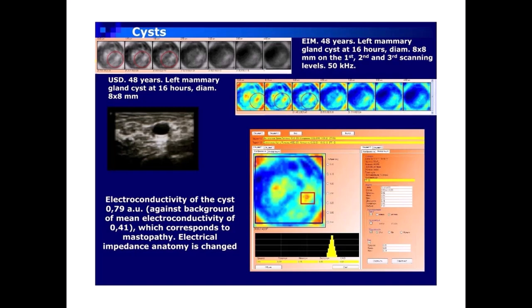Cysts EIM case: 48 years, left mammary gland cyst at 16 hours, Di-AM 88 mm, shown on the 1st, 2nd, and 3rd scanning levels at 50 kHz. Ultrasound: 48 years, left mammary gland cyst at 16 hours, Di-AM 88 mm. Electroconductivity of the cyst: 0.79 AU, against a background of mean electroconductivity of 0.41, which corresponds to mastopathy. Electrical impedance anatomy is changed.